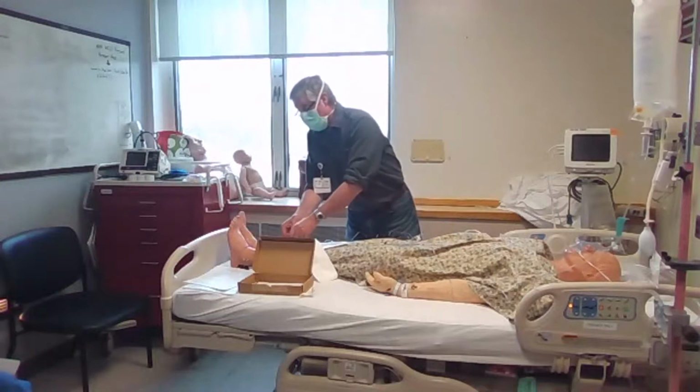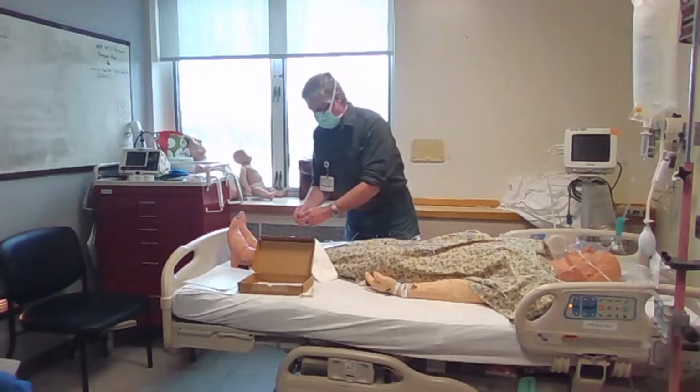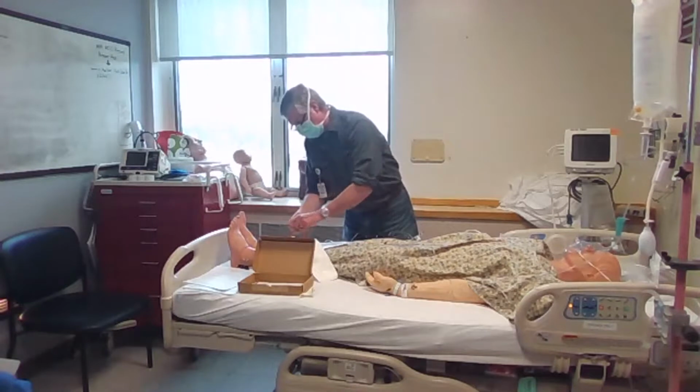So it comes with different little color ones that you add after? Yep, they're inside the kit. And a lot of times people will wonder what those are, and that's an easy way to remember that you've got the ones with the holes in them. When I see these, I always go, oh yeah, I've got holes in them.